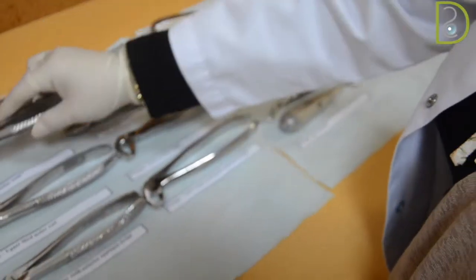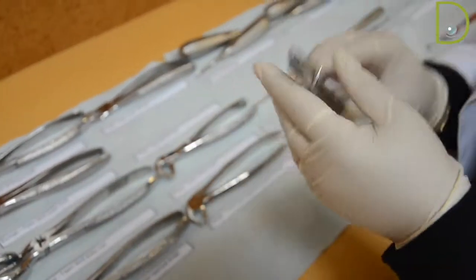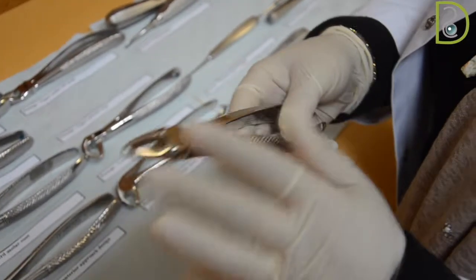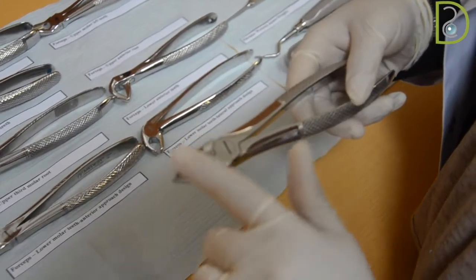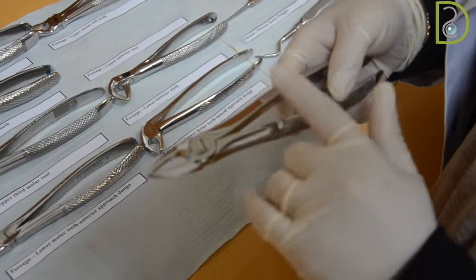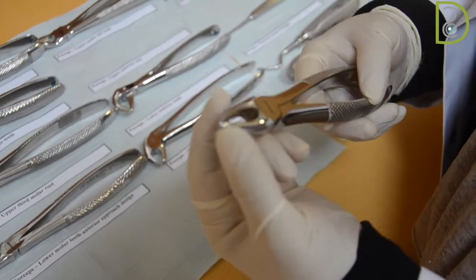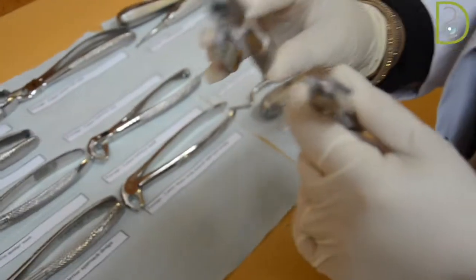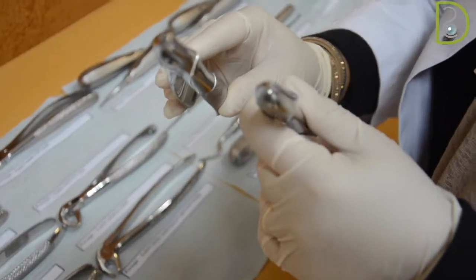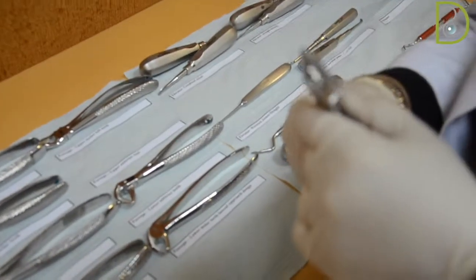Now, for the root forceps, most of the root forceps come in a closed manner this way. As we said for the upper anterior forceps, you will find the beaks at a parallel angle to the handles. There is nothing other than the closed beak to differentiate it from the upper anterior teeth forceps, whose beaks are open. This open design helps in grasping the conical shaped anterior roots.